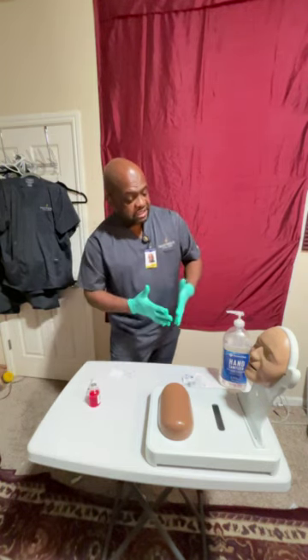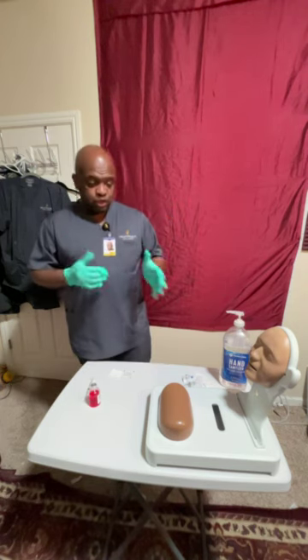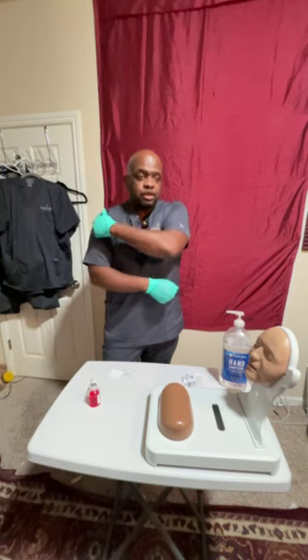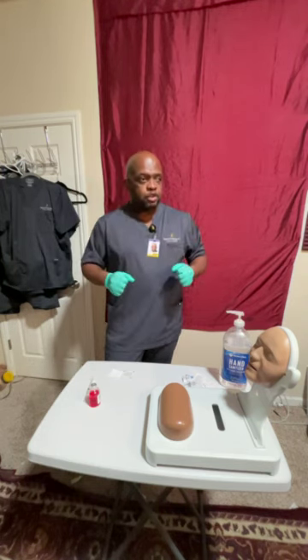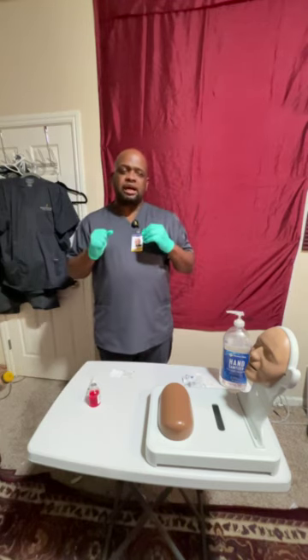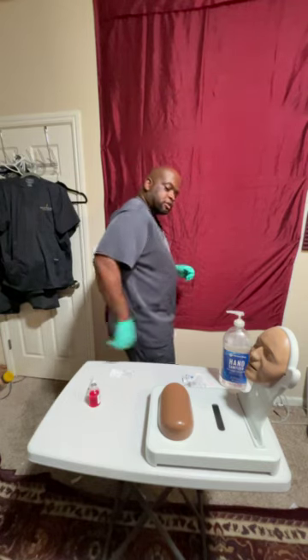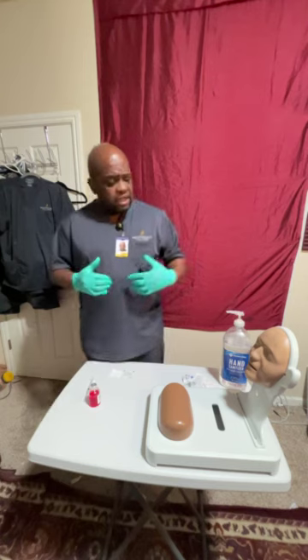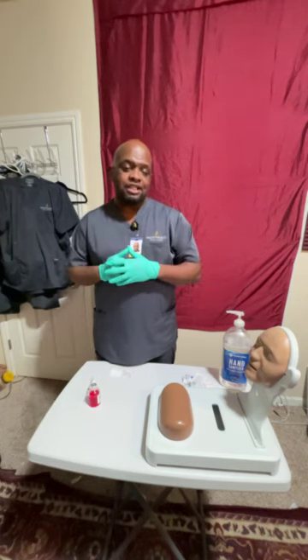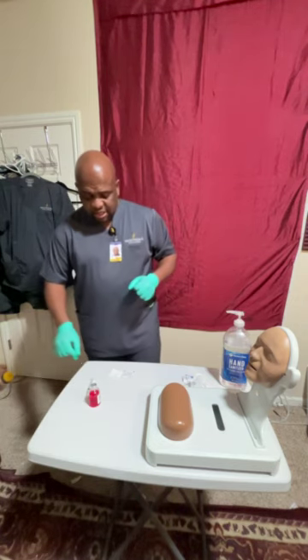And from there, Mr. Jones, when you receive this injection, it's going to be kind of a stinging sensation. There are 3 areas that you can choose from for this injection. You can choose the deltoid area. You can choose on the side, your vastus lateralis, or you can choose the ventrogluteal. That's just like the upper hip muscle right there, the ventrogluteal, right? Mr. Jones has chosen the ventrogluteal for the injection, so that's where we'll give him his injection. Once again, like I said, you will feel some stinging sensation there.